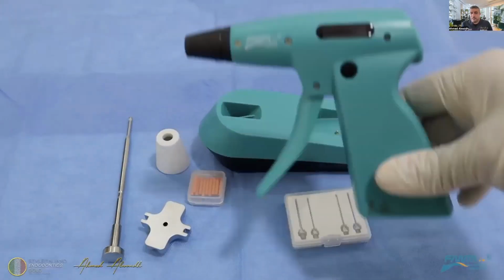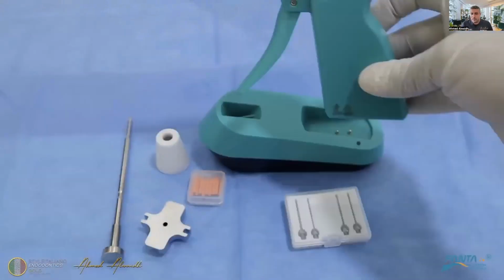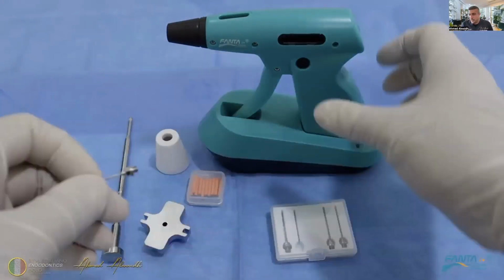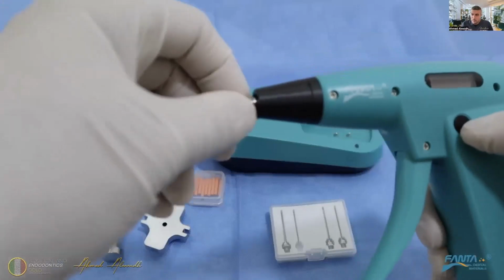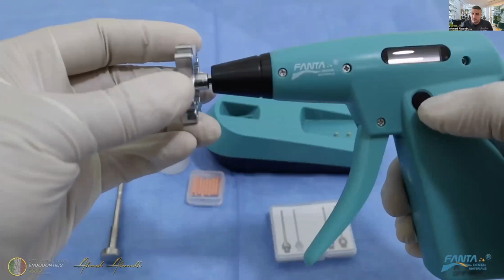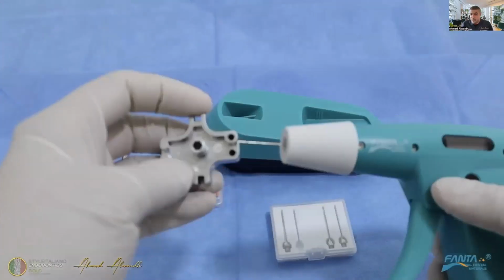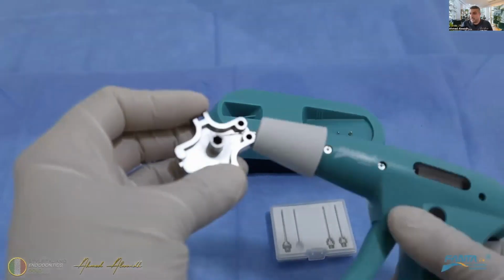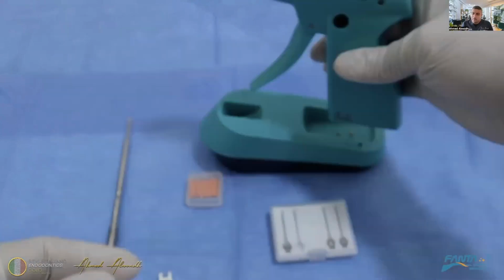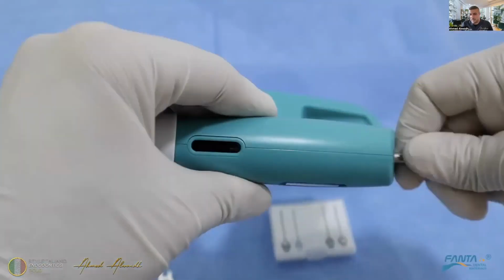How are we going to use it? It's also very easy to use. So this is the device, and we have only one button. Long press the button. It's for activating, on and off. Now we put the tip, okay, and there is the key. We can fasten the tip to prevent any excess of melted gutta-percha, and we put this cap because this portion of the device is hot. So this is to give protection. Then we adjust the tip by the key, not by hand, because it may fracture.